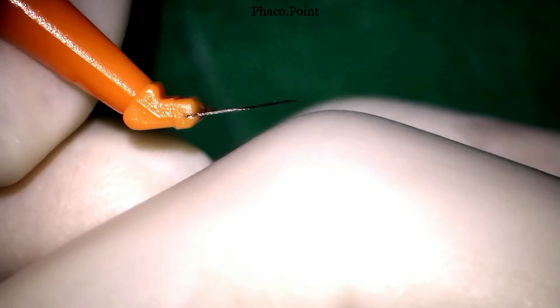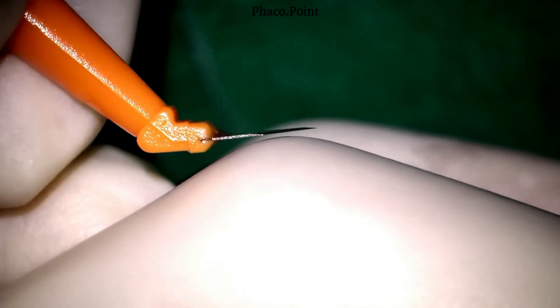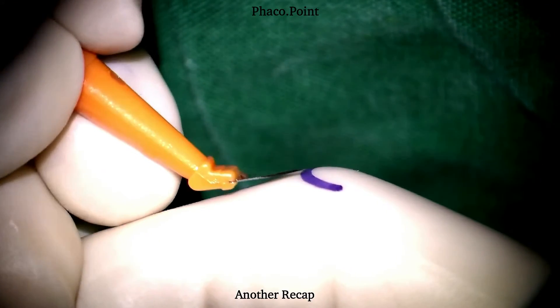Here's a quick recap. Once the blade is in position: depress, engage, elevate to get the correct length in the cornea, straighten, pierce, and then in and out. Let's now see the same movements a couple of times more.